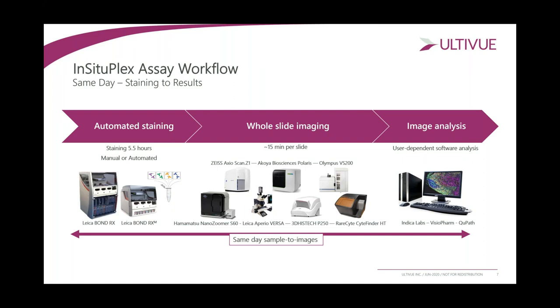Once you've stained all of those slides, which would take about 5.5 hours, now it's time for imaging, where you have a whole suite of images to choose from. Usually, this takes about 15 minutes per slide. It depends on the size of the tissue and other factors, but usually we'd say it takes about 15 minutes per slide to acquire all of that data.